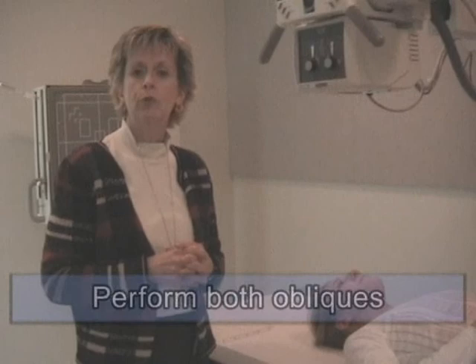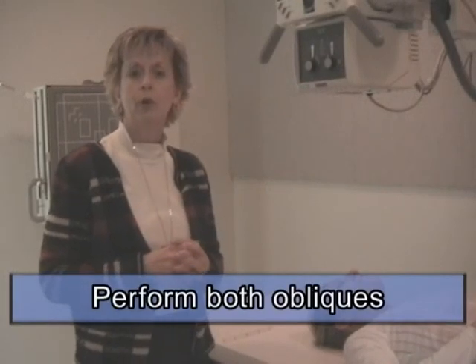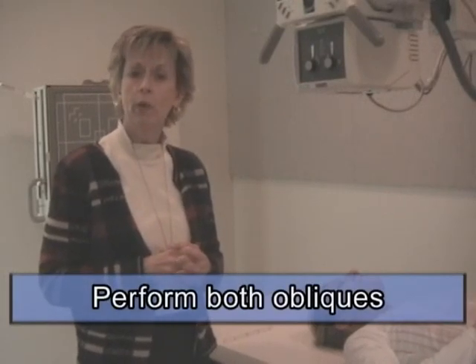And the obliques, if they are part of the routine procedure, then you will do both obliques, either both anterior obliques or both posterior obliques, and they're to demonstrate the intervertebral foramina. And that's a summation of today's lesson.